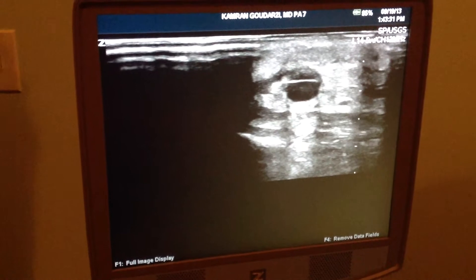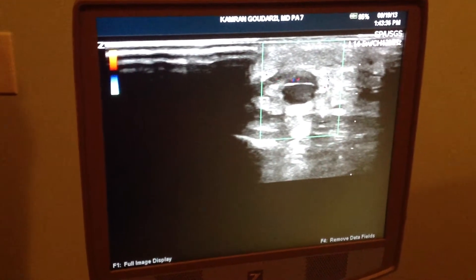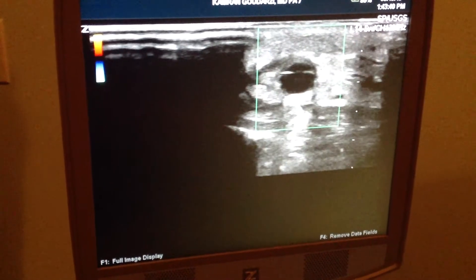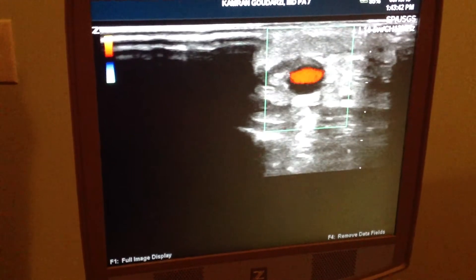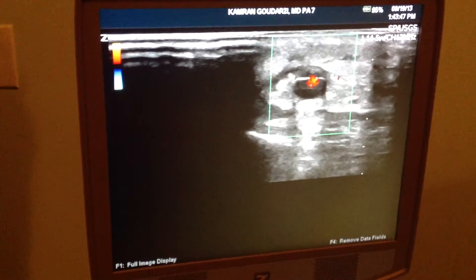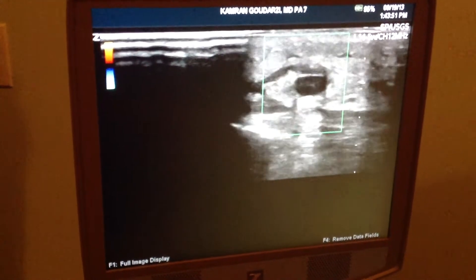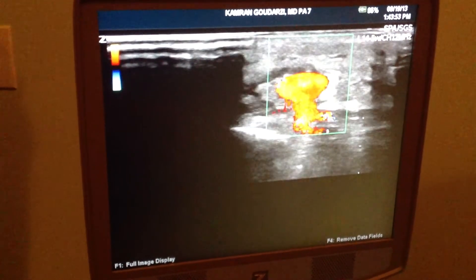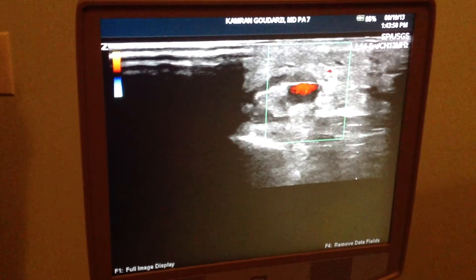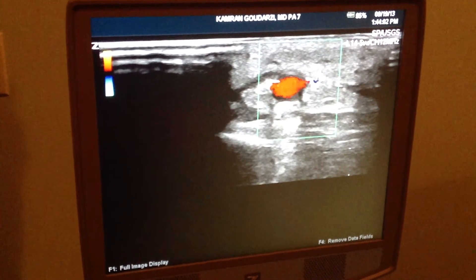Now we're going into color and you can see that the valve is wide open. I'm injecting it and letting go. Then we are going to push proximally. You can see the blood is actually moving backward and essentially sitting there and not going very far. Now we're not squeezing anything.